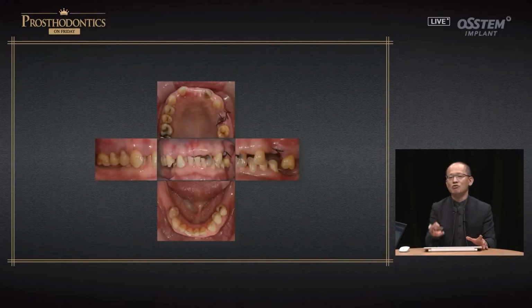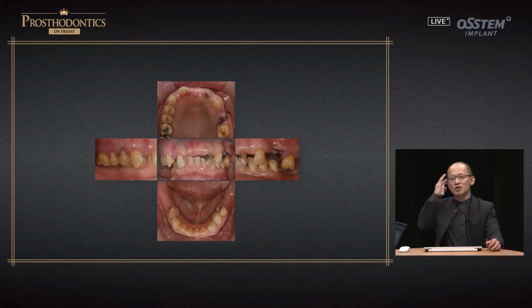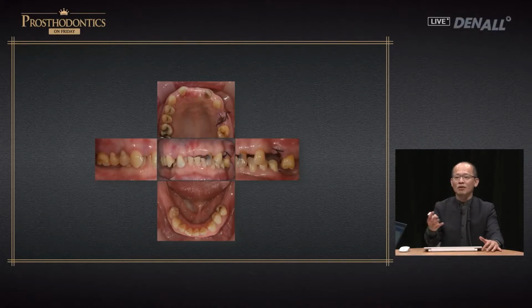But the time factor is important, because categories 1, 2, 3 are not really black and white. Some come as a very simple case, but they came too late, so requiring full mouth rehabilitation. So it's a mixture of different categories for patients. So you have to watch the patient conditions carefully.